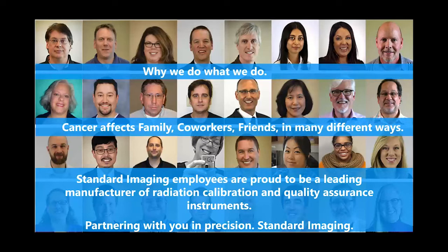We want to be your partner in precision. So keep us in mind when considering anything from our software to our ion chambers, electrometers, water phantoms, stereotactic phantoms, etc. We have a whole host of products.